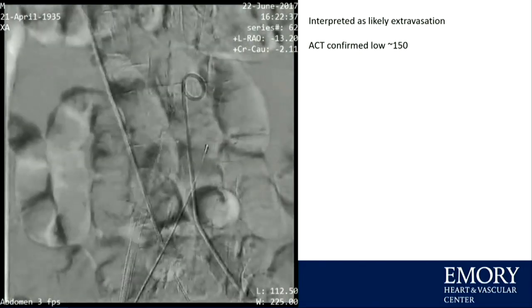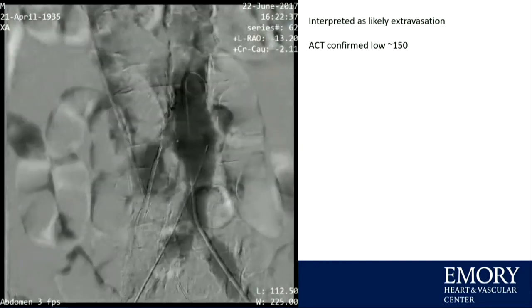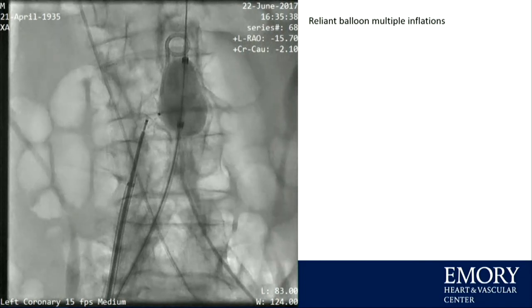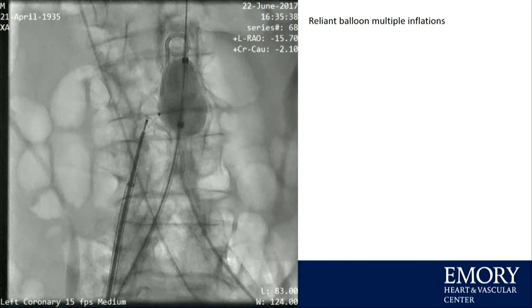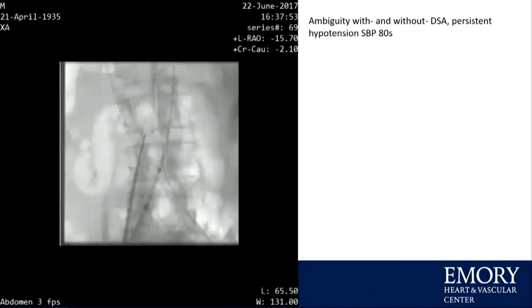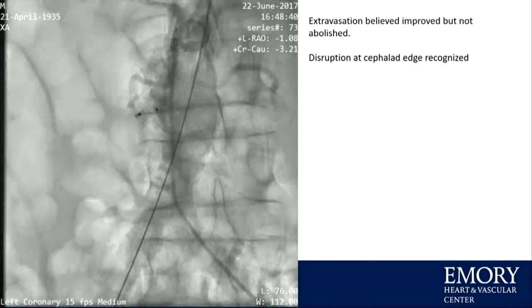We took this picture, and this is something you often get with transcaval. You see a lot of shifting bowel and stuff, and it's hard to know, are they bleeding? Is that flow just shifting bowel, or is that actual bleeding? But the telltale sign that they're bleeding is that they're hypotensive, right? Because they won't be hypotensive if it's just a shunt. So there's a Reliant balloon going up, and you can see that focal sort of sausage pouch, because this is really not a good place to be doing the procedure from.